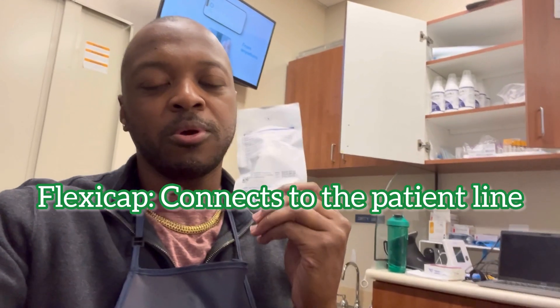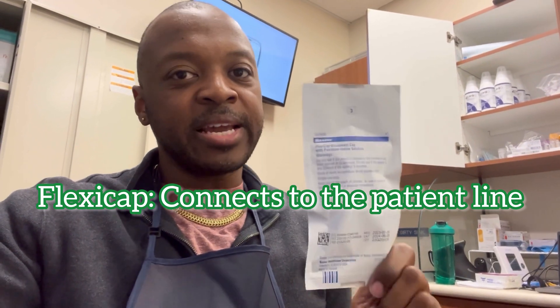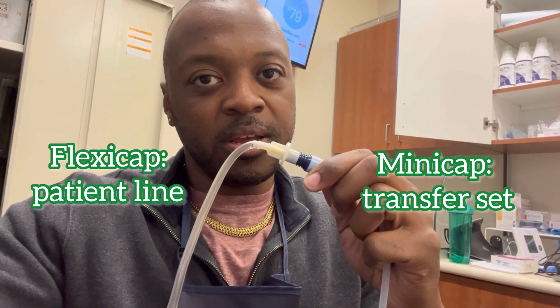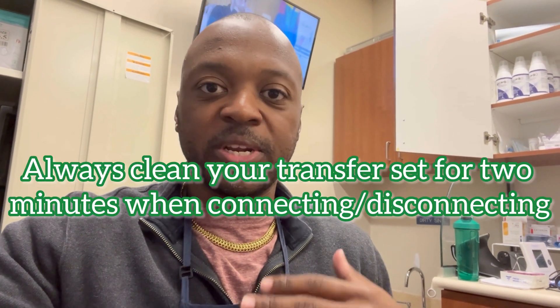I'm going to introduce you to a new item called the flexi cap. I haven't talked about this yet. The flexi cap is kind of like the mini cap — the mini cap goes on the end of your transfer set, while the flexi cap goes on the end of the patient line. I'm going to clean my transfer set, do a one-minute soak and one-minute scrub, disconnect my transfer set from my patient line, put the mini cap on, put the flexi cap on, and go to the bathroom and come back.